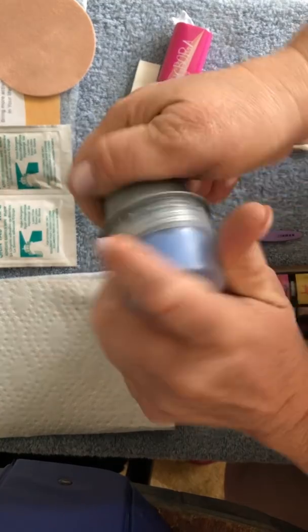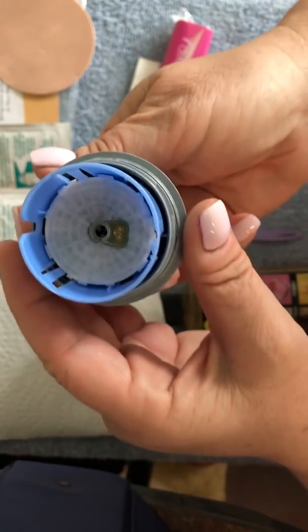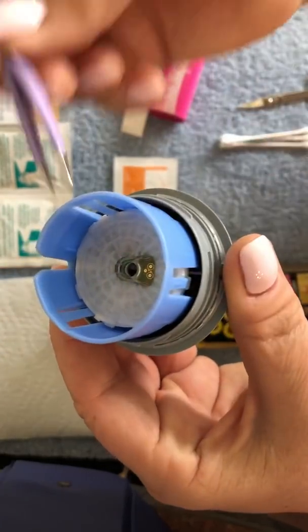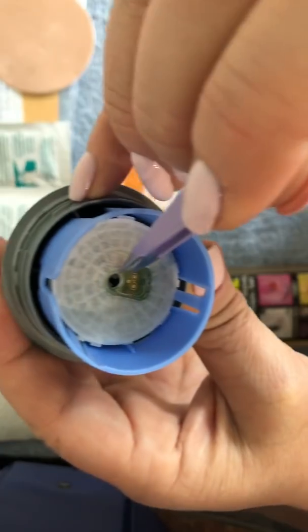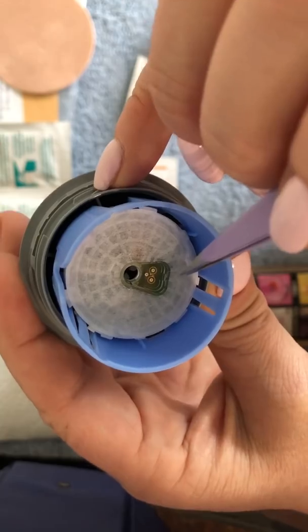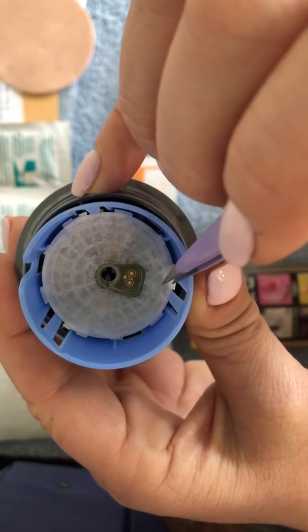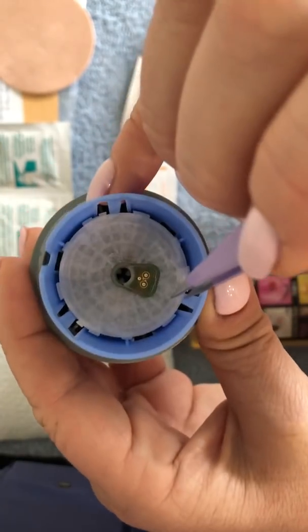So we're going to take it out of the unit. I want you to be very aware of how this sits in the unit, because this is very, very important. What you'll notice here is there's only one side on the sensor that has this deep groove. I want you to look at the groove in relationship to how this is sitting in there. It's very, very important that you put this in the exact same way that it came in. And forgive me, I'm not a YouTuber or very good at videos, so this is not the greatest, but it'll help you out. So see how it sits in there, and make sure you make note of that.